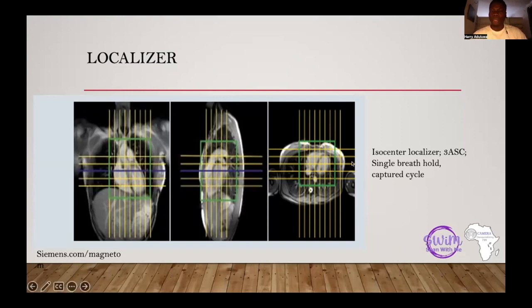Then number two, look at this green stuff. Shimming is very important. Every system comes, you should just learn how to locate shimming on your system. For GE, for Siemens, there's a section of the MRI that they write help. You could just type shimming in that help. That will direct you to where you can pick out shimming from your system.